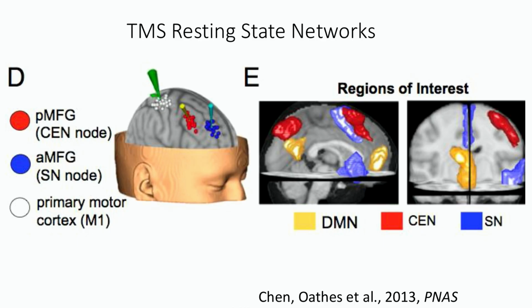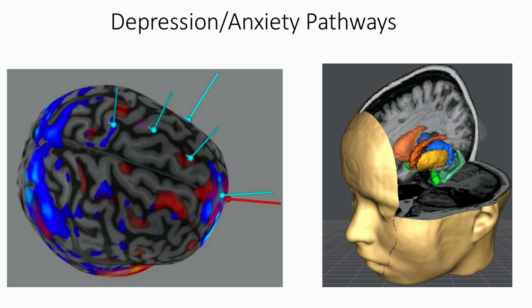So showing that there could be a way, if, for example, you really want to turn off the default mode network and you assume through the correlative imaging that there might be a relationship, this is a good kind of basis for predicting that relationship would happen.